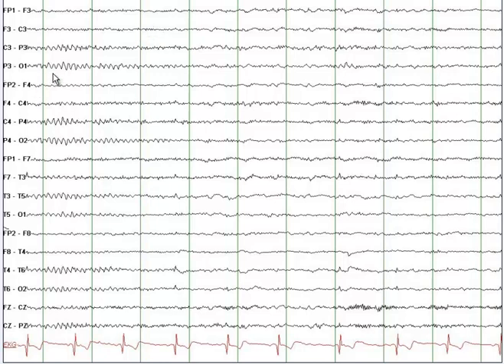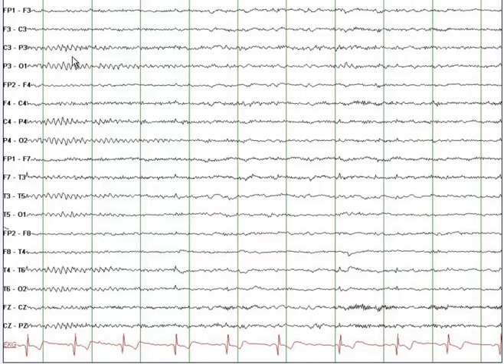The defining feature of stage 1 sleep is a drop in the alpha rhythm. These dark green lines are 1 second apart. If you count the number of waves between these dark lines at the P3O1 channel, you count 1, 2, 3, 4, 5, 6, 7, 8, 9 — so a frequency of 9 Hz, which is within the alpha band.